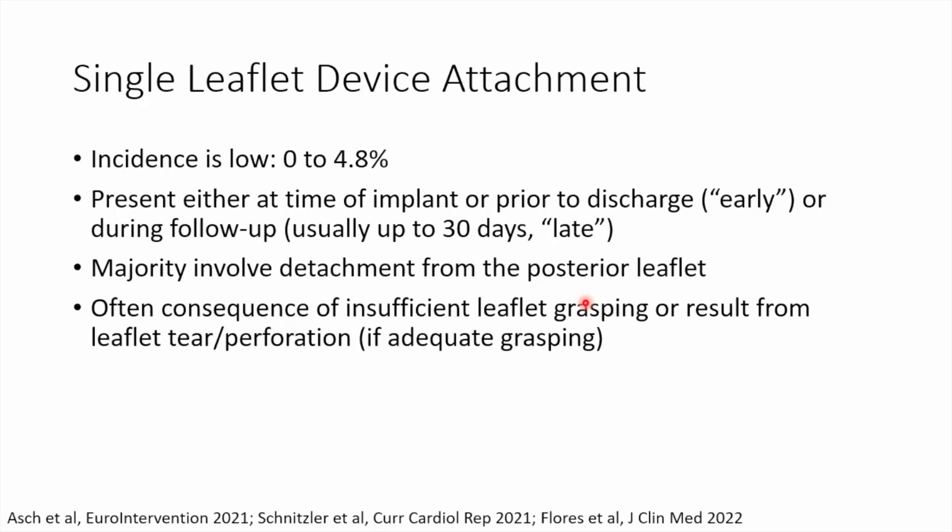And then usually there are the consequences of either there was insufficient grasping, so you don't have enough grasp of the leaflet, and so part of that leaflet tip just fell out of the clip. Or if you did have adequate grasping initially, there was some tear or perforation that actually caused the leaflet to completely detach from the clip as well. So leaflet tear or perforation can actually cause you to have complete detachment in SLDA.